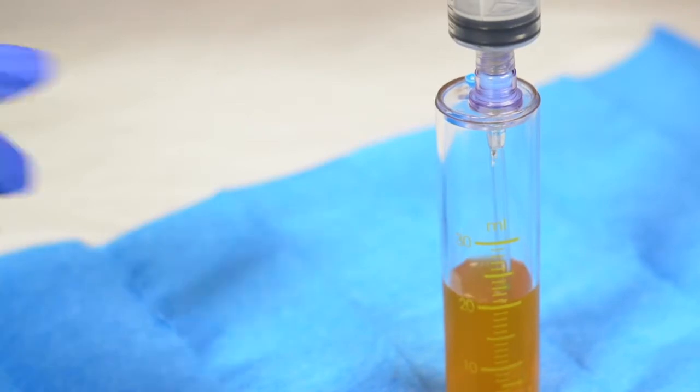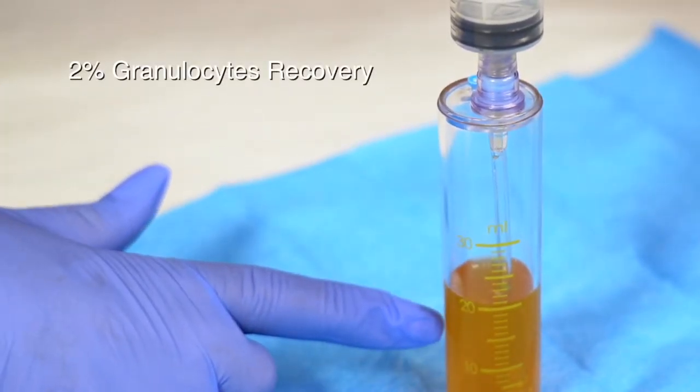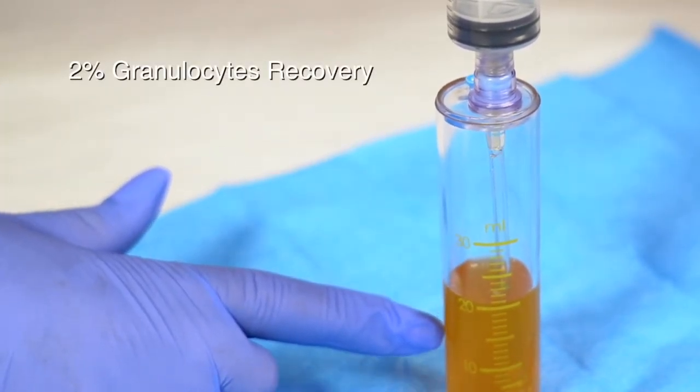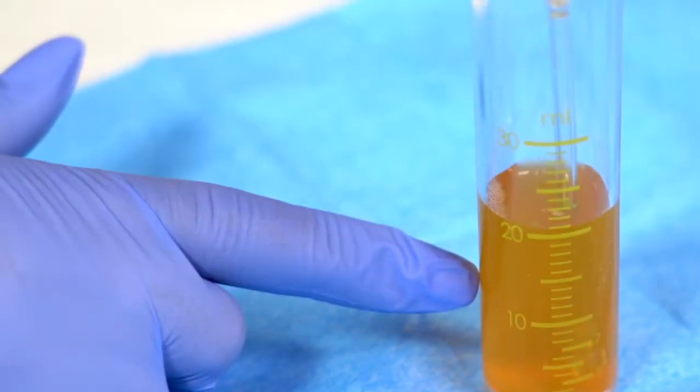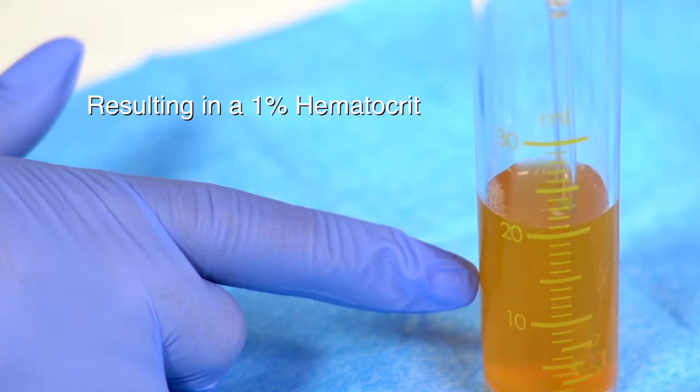PureSpin PRP has a 2% granulocytes recovery, providing for the perfect ratio of white blood cells in concurrence with the lowest concentration of red blood cells, resulting in a 1% hematocrit.